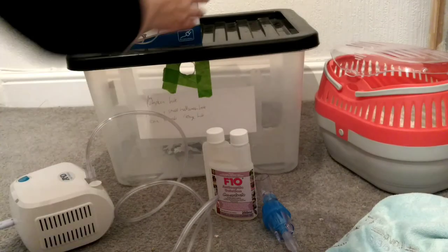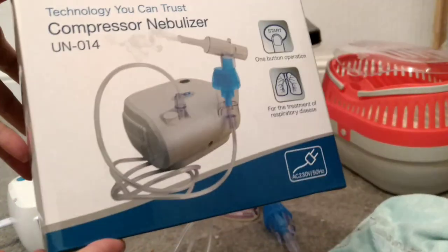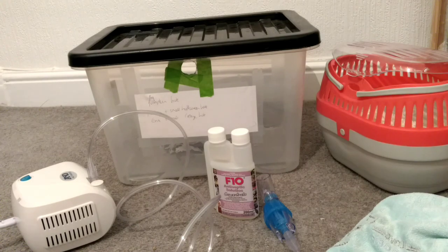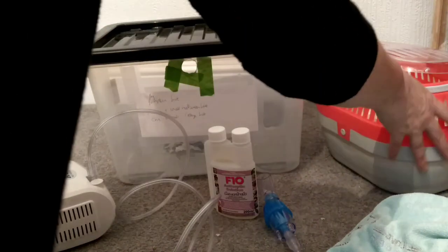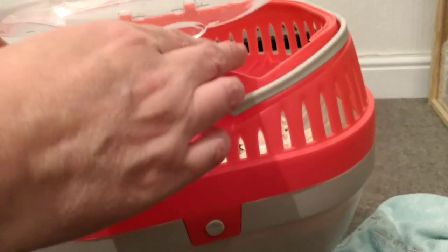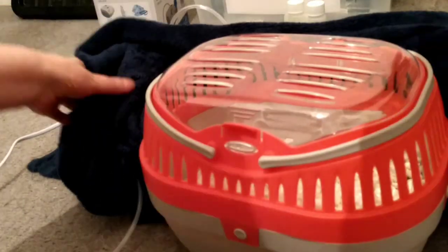First off, I bought the cheapest nebuliser I could find on Amazon — I think this is about £37. And then you'll need a chamber. A couple of ideas: you could use a travel carrier and then put a plastic bag around it and try to put the nebuliser through it. You could also cover it with a towel or something — anything just to stop the vapour seeping out.